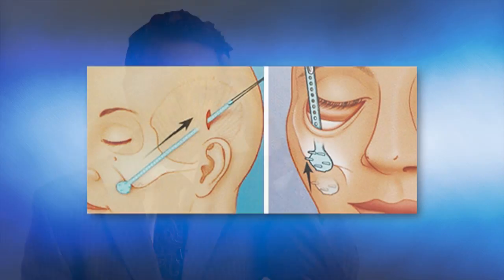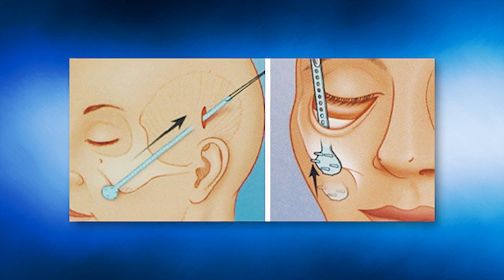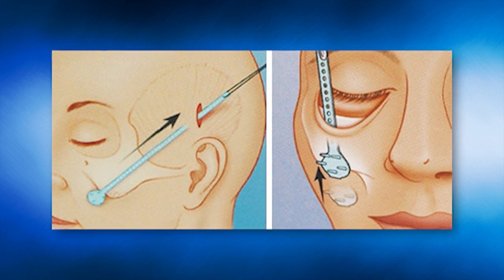We can place the incision either up in the brow when we're doing a brow lift, or if we're doing a lower eyelid blepharoplasty, we can approach it through the lower lid. When we do this through the brow, we use an endoscope and we create a tunnel basically from the lateral brow all the way down to the cheek. And we can free off those cheek structures, bring that cheek up, and put it back where it used to be.